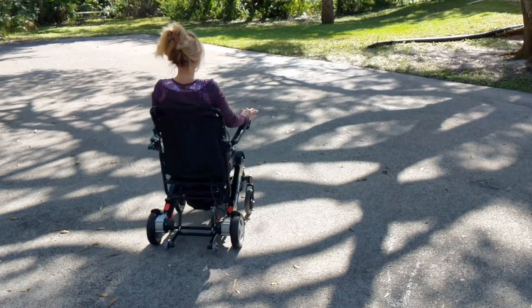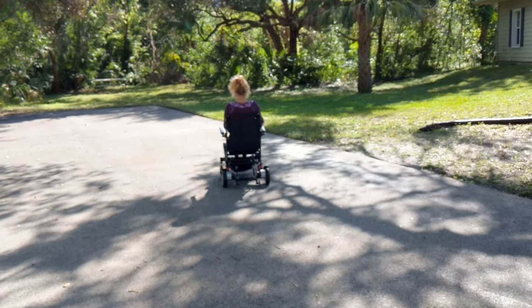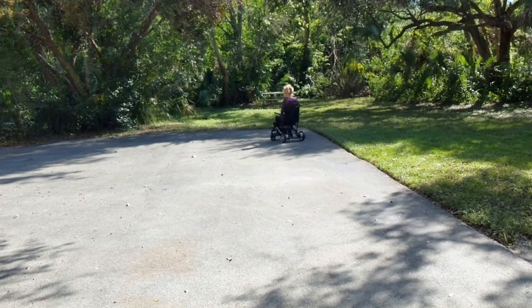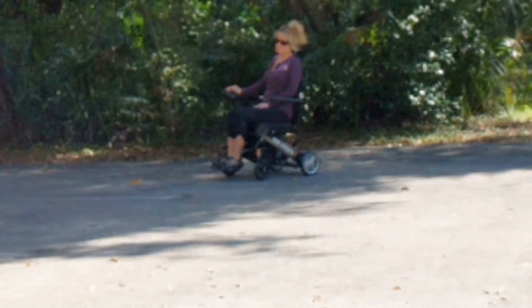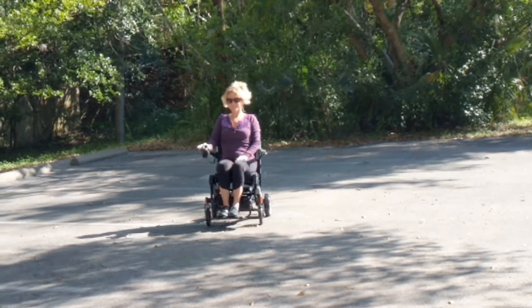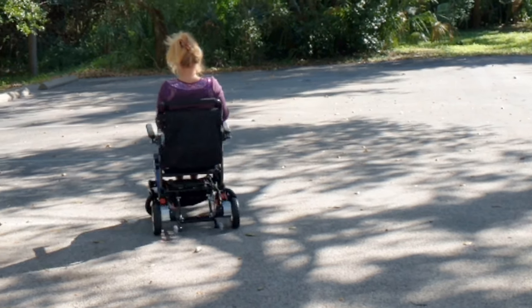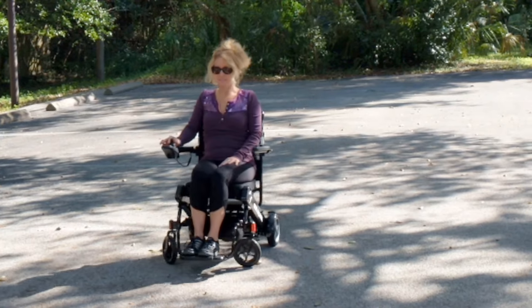Off she goes. You can hear how quiet that chair is and you can see what an absolutely beautiful day it is outside. How easy the chair is to operate, how easy it is to maneuver. It goes up to a little bit over four miles per hour and turns easily on a dime.